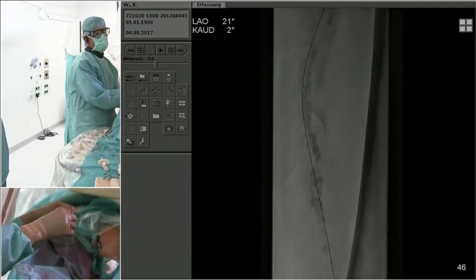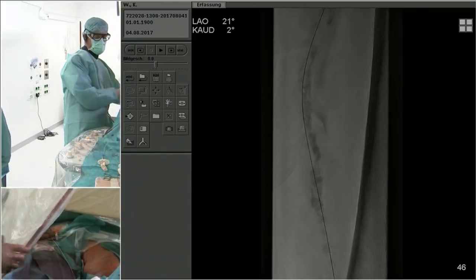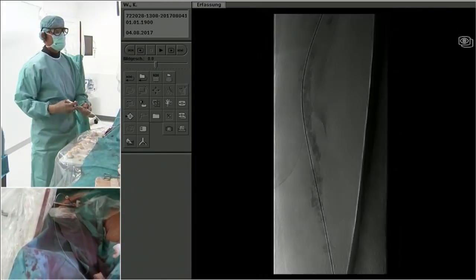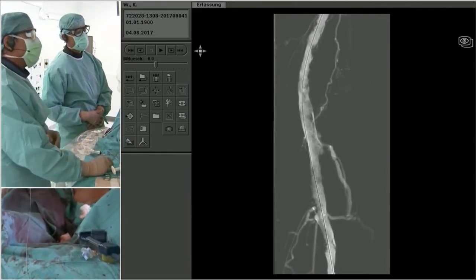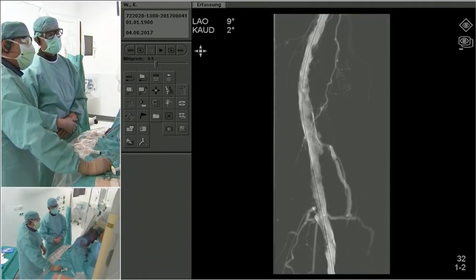So what's really interesting is you're deciding in advance of the implant whether you're going to go with Viabond or Supera primarily. Because if you're going to go with Supera, then you're going to take big balloons very aggressively. If you're thinking Viabond, you're not going to dilate as aggressively until you place the graft. I mean, that's a pretty good balloon dilation alone.